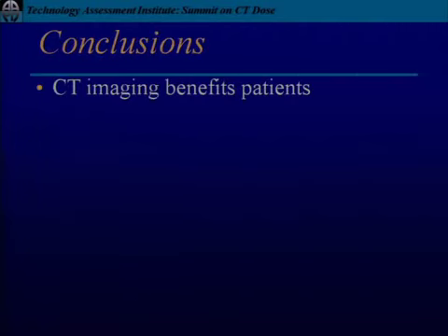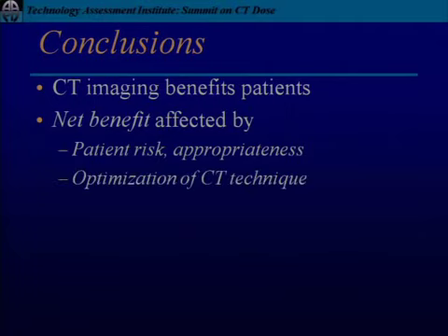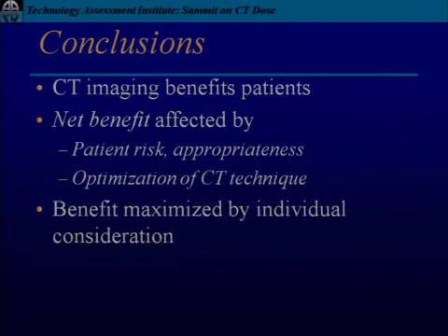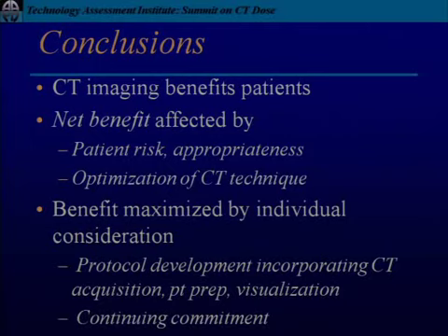So I think CT imaging really greatly benefits patients in practice, particularly as referring physicians realize the individualization of current CT scanners. There's the net benefit that's affected by the patient risk and the appropriateness of exam, as well as the optimization of the CT technique. The benefit is maximized by individual consideration. And we really need protocol development incorporating CT acquisition, patient preparation, and visualization, and a continuing commitment to this as scanners evolve and more clinical data emerges.